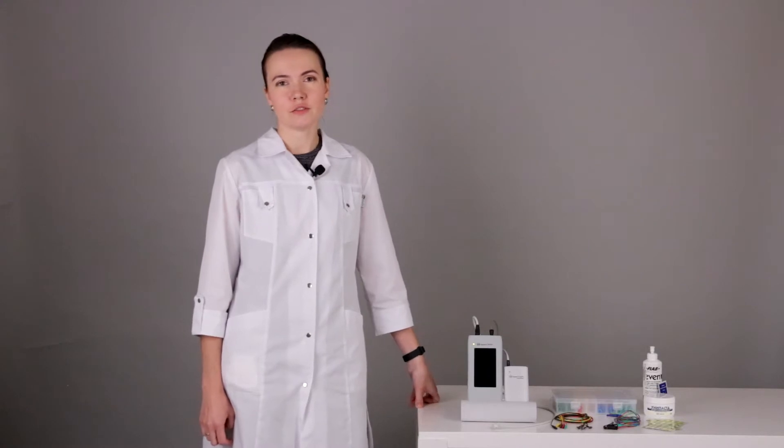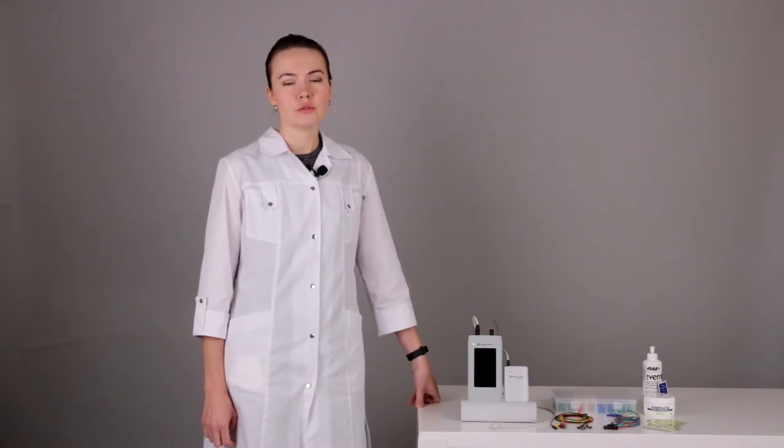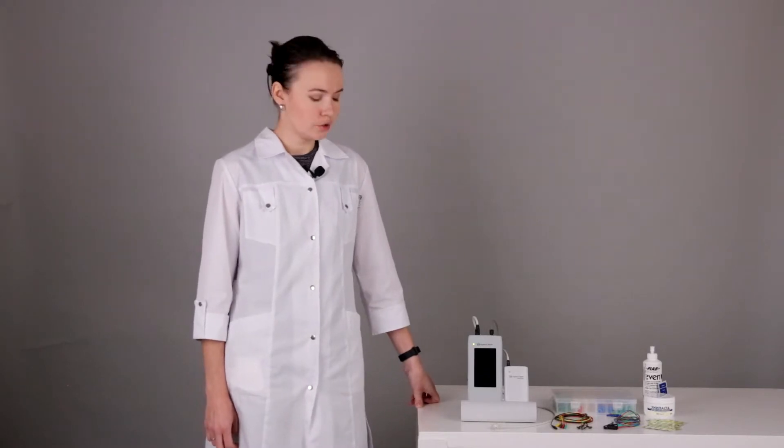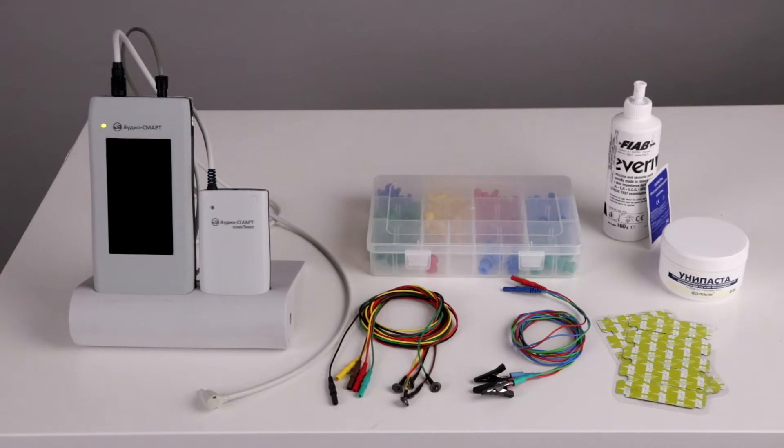Hello, my name is Maia Petrova. I am a medical consultant of Neurosoft Company, and today we will perform automatic auditory brainstem responses and auditory brainstem responses in a baby using the AudioSmart device.